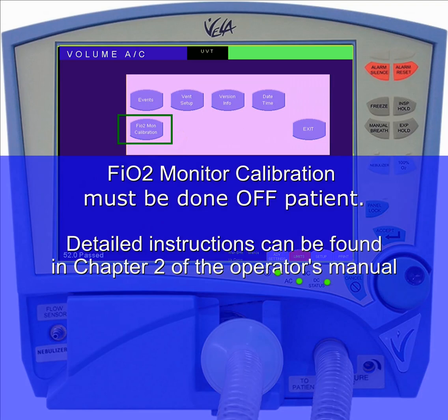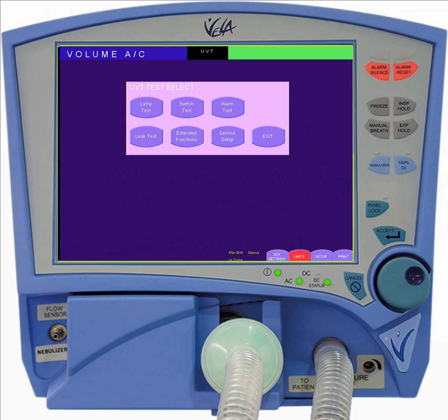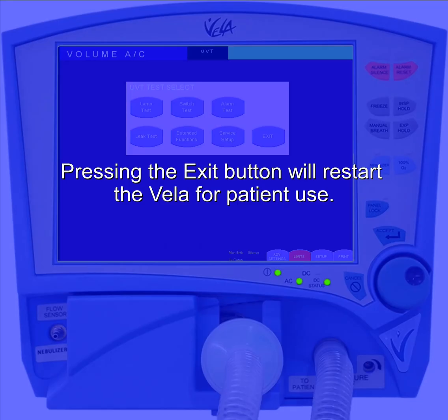Extended functions gives you access to the FiO2 monitor calibration, which must be done off-patient. Detailed instructions can be found in Chapter 2 of the Operator's Manual. Pressing the exit button will restart the Vela for patient use.